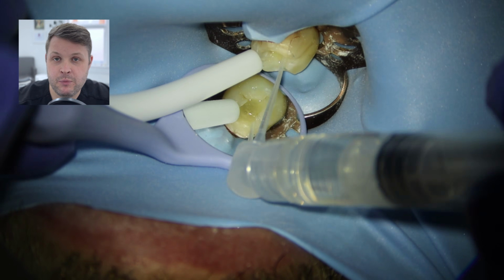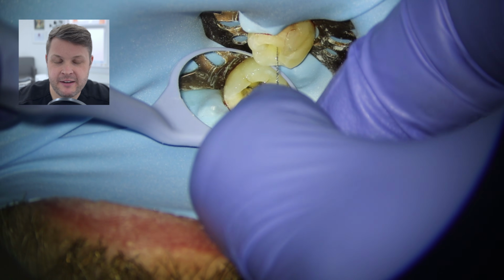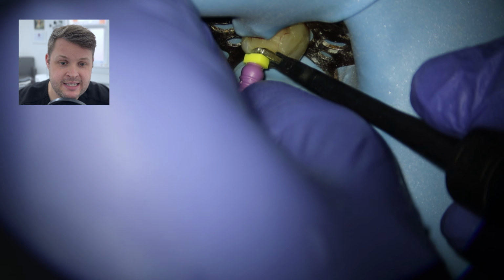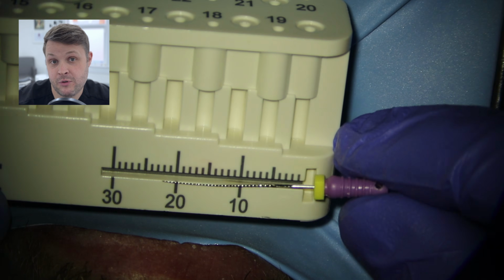So we're going to go back in with our size 10K file down the mesiolingual. We're going to do a little bit of watch winding, very nice movements, not trying to push the file too far, because obviously you're going to ledge the tooth, and you can feel now that it's going a little bit further. And when we place our apex locator onto this file, we can feel we're going to get a nice 0 reading, and when we pull this K file out and measure it, we can see that the 0 reading in the mesiolingual canal is at 24 millimeters.